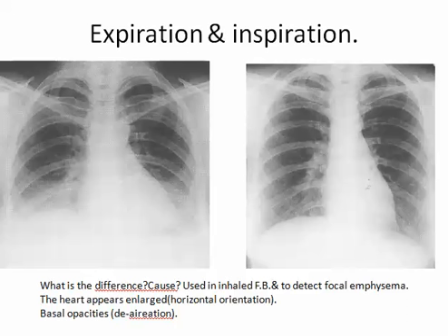Between expiration and inspiration, what is the difference? What is the cause? And why do we use it? We use it in some cases of inhaled foreign bodies or to detect focal emphysema.